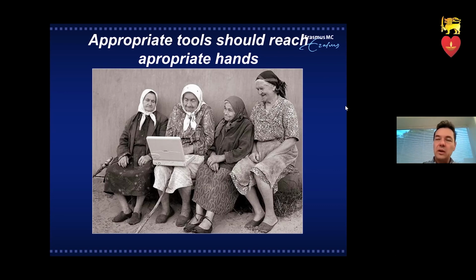So in that kind of situation, I prefer to create a Culotte and get a good position and avoid a lot of metal on one side, inside my other stent. Or if possible, if the angles are favorable, you can also do a TAP really easily in that situation. Okay, thank you.